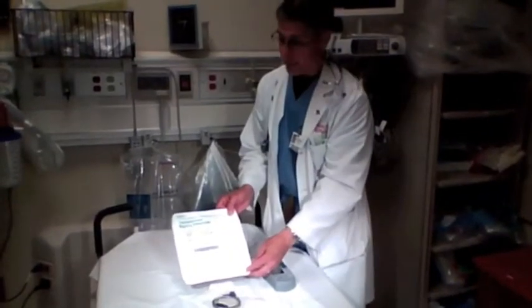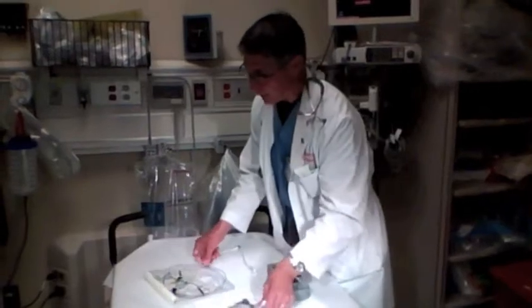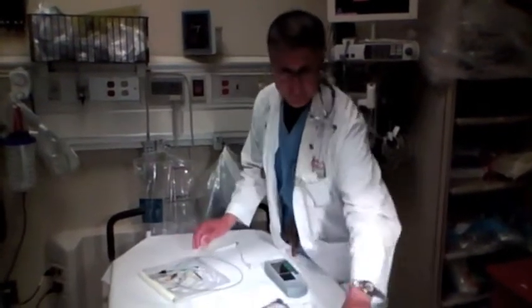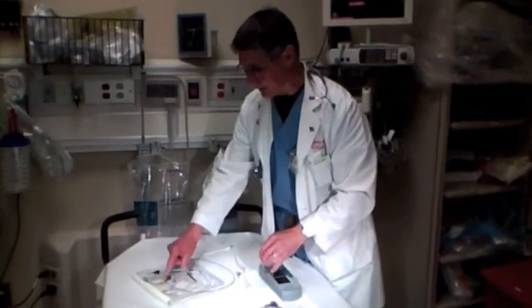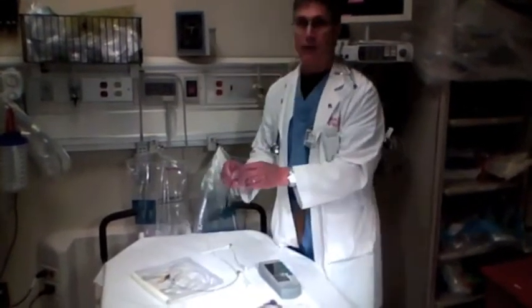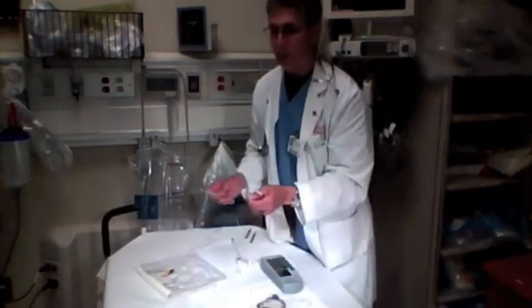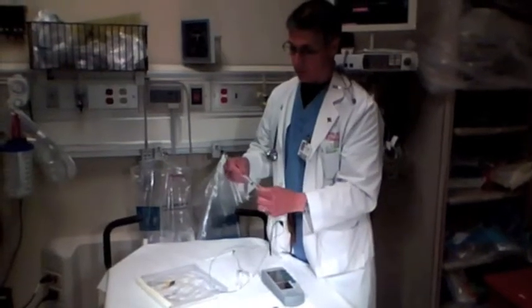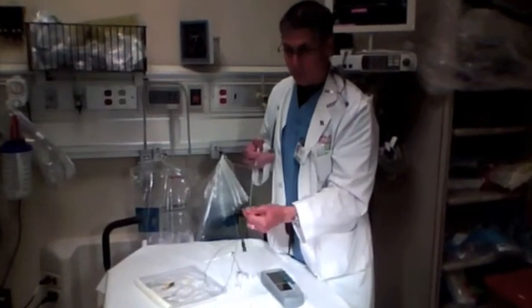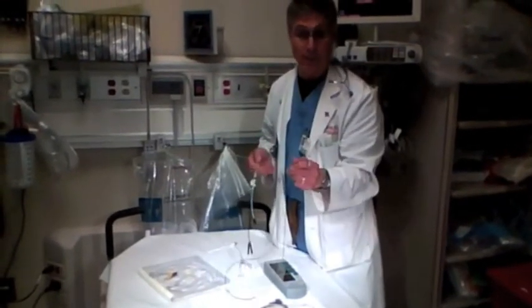This is the transvenous pacing system. If you open it up, you'll find a wire, a sleeve, a small syringe, and some other little connectors. On the end of this wire is a little balloon. A syringe hooks up to that balloon — when you inflate it, the balloon blows up and acts like a sail, floating right into the ventricle. That's how you place the pacemaker.